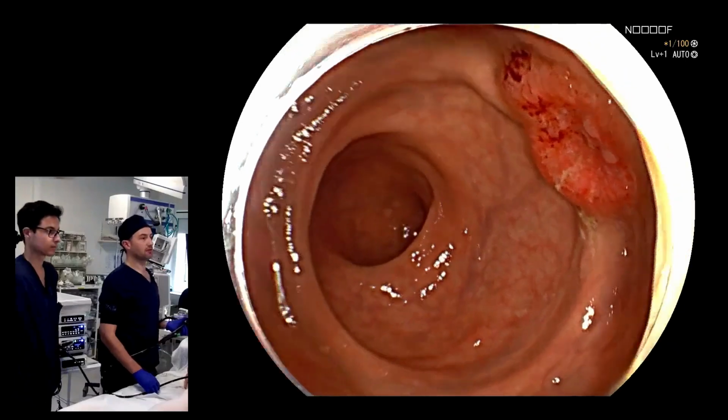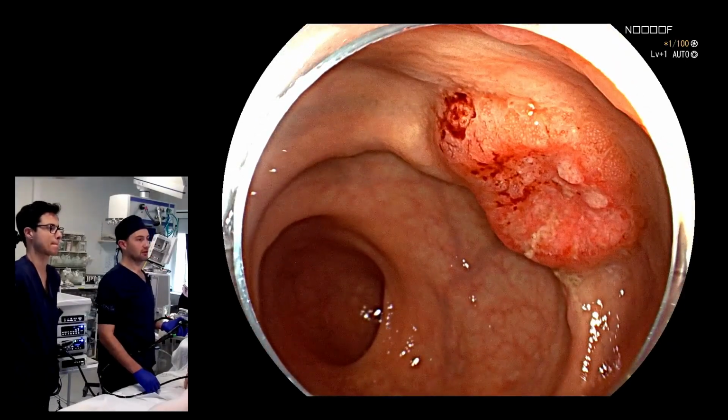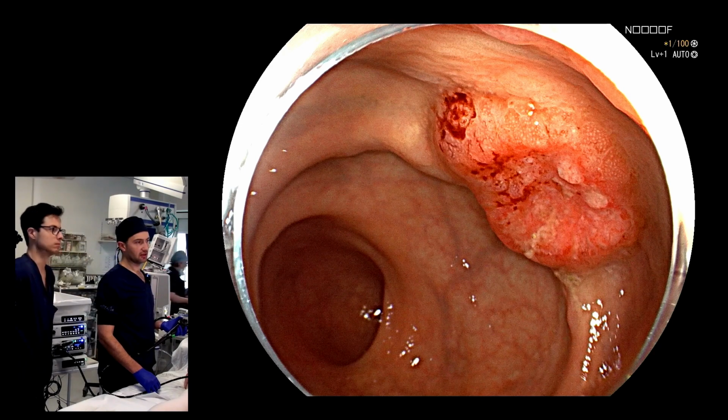Right, first impression. Here we go. So my first impression: very red in the center, depressed, a bit of chicken skinning around the outside. I think you can clearly see from here.